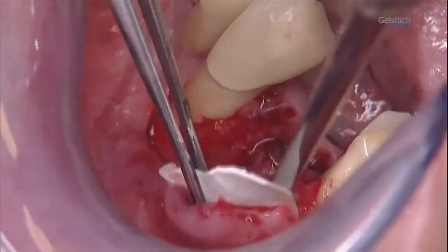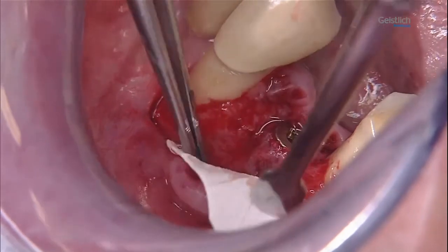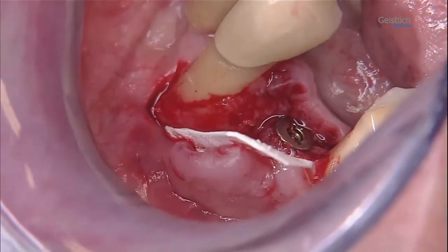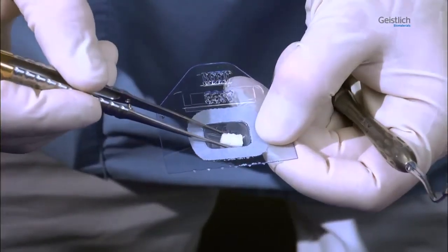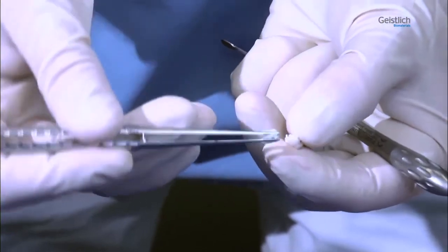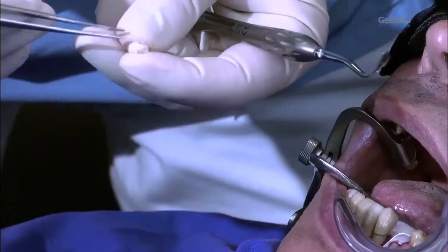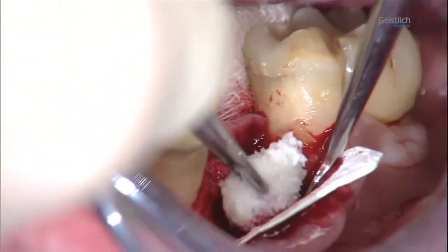The collected autologous bone is applied in close proximity to the implant. The Geistlich Bio-Oss Collagen block consists of 90% Geistlich Bio-Oss granules. The remaining 10% is collagen, which holds the Geistlich Bio-Oss granules in the block together. This collagen has no barrier function. The barrier function is provided by the Geistlich Bio-Gide membrane.